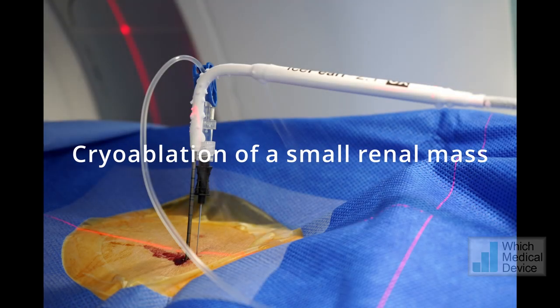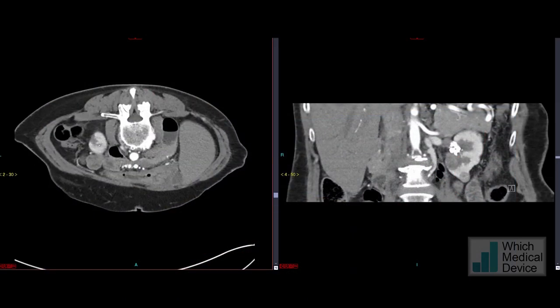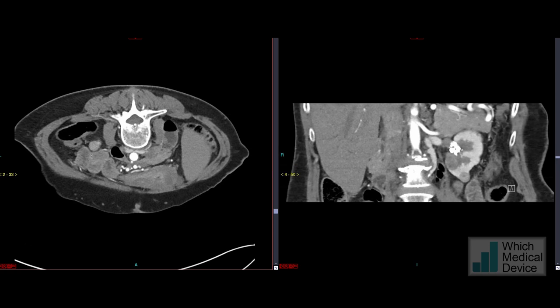This is a short video made to illustrate how we perform cryoablation for a small renal mass. This patient has a solitary right kidney with a small enhancing renal mass arising from the lower pole, which is very close to the small bowel.